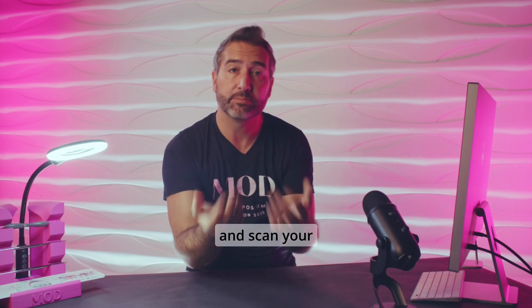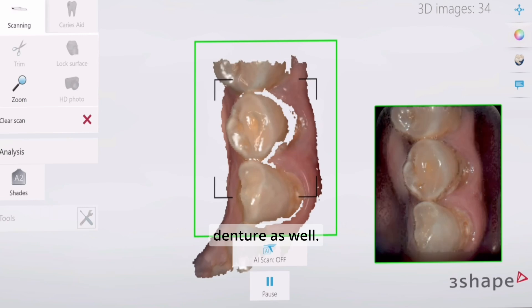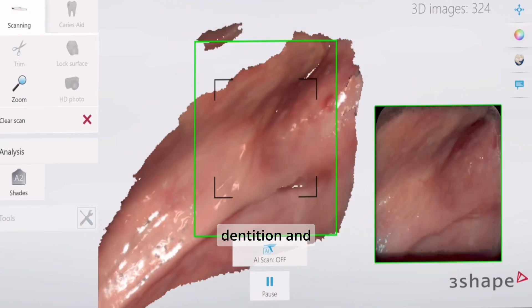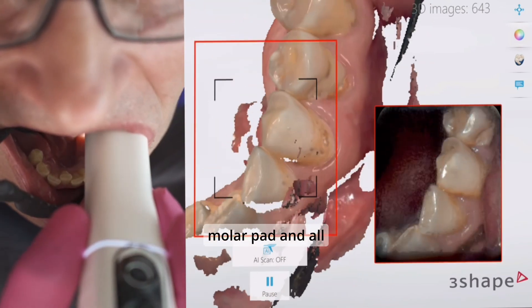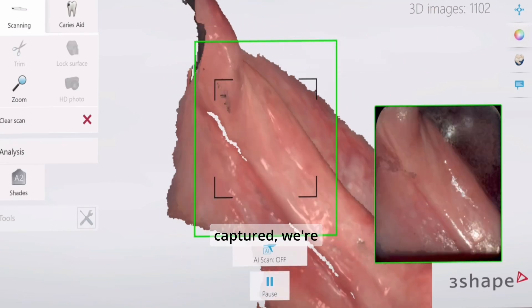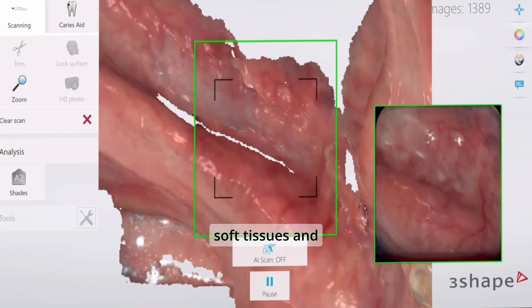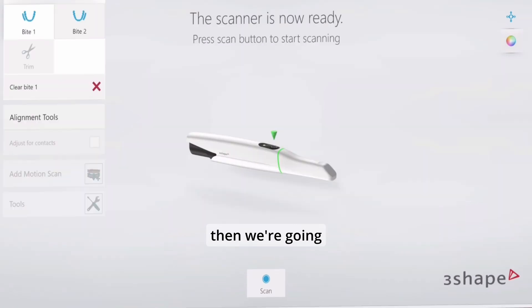Next, go ahead and scan your opposing arch. In this particular case, we're doing a lower partial denture as well, so we're scanning the mandibular dentition and making sure to get two-thirds up the retromolar pad and all the way into the retromyohoid fossa with our intraoral digital impression. Once we have that captured, we're going to ensure that we have all the necessary soft tissues and hard tissues from this scan, and then we're going to get our bite.